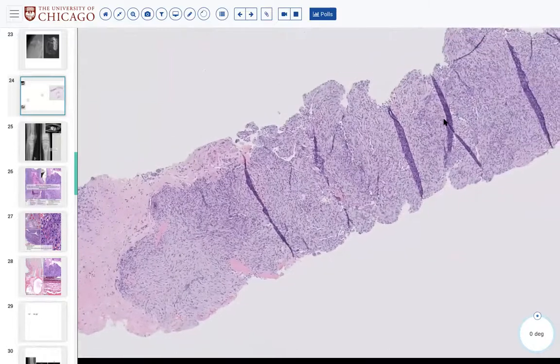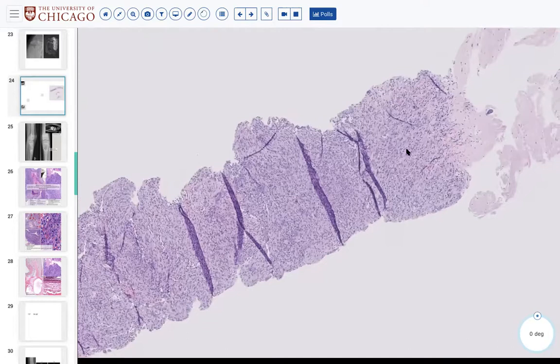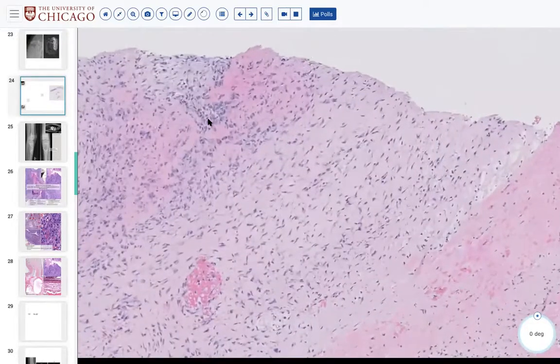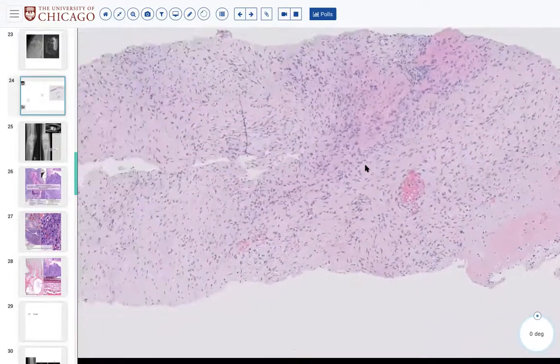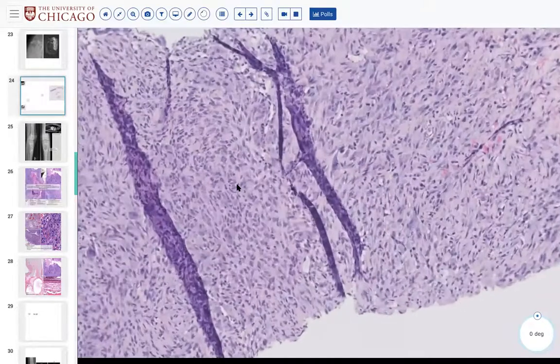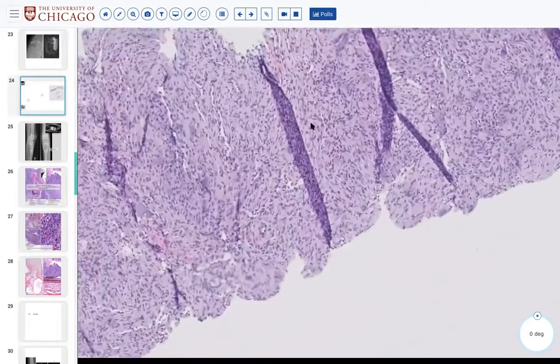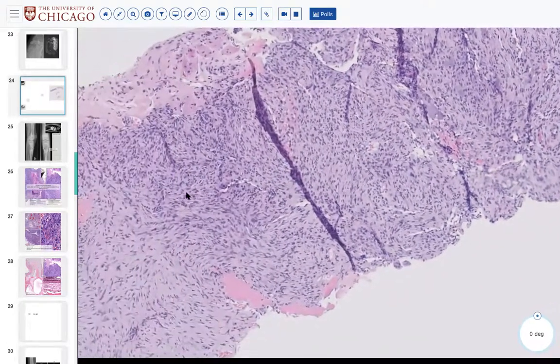So I was with Perry the entire time until I just got to know that it appears cystic. That's the first thing I think of when somebody tells me that it's a cystic bone lesion, and I see osteoclast-like giant cells and then bland fibrostroma with some vessels. So that's why I jumped on ABC, because I thought it's not going to be non-ossifying fibroma.